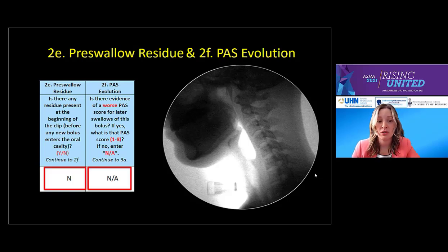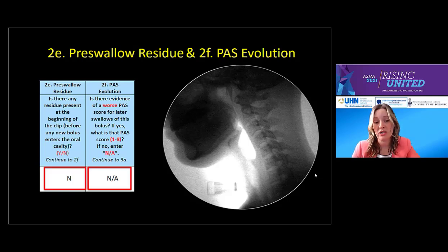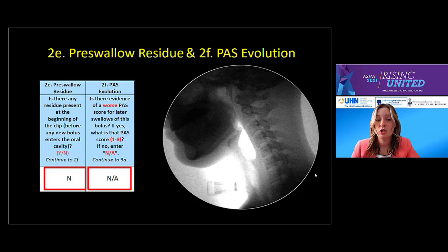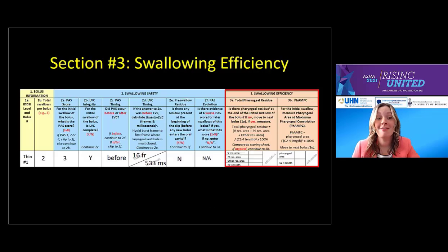Our last step in the safety section is 2F, PAS evolution. When a patient swallows multiple times on the same bolus, there may be multiple PAS scores — for example, the first swallow may score a 2 and the second swallow a 3. We want to capture this worsening if it occurs. In our patient's case, she swallows twice on this bolus. The first PAS score is a 3 and the second is a 1. Because her PAS score does not get worse, we write NA.